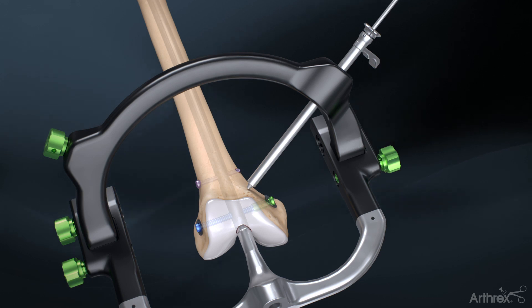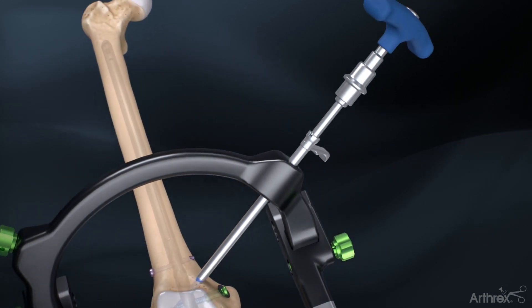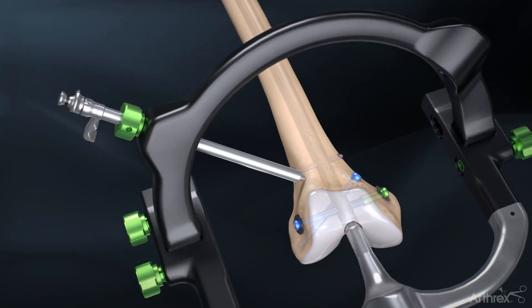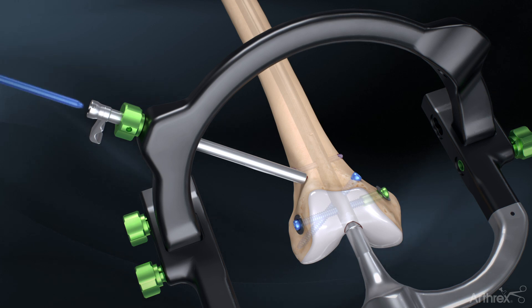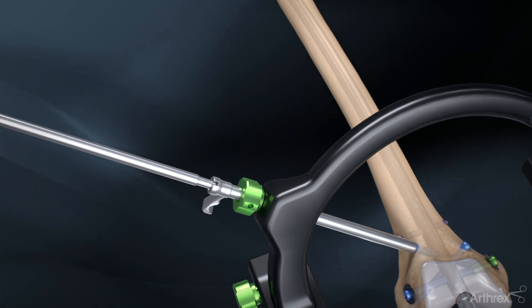Repeat the screw insertion process through the anteromedial hole in the targeting guide. This process is repeated with the screw sheath, drill guide and obturator assembly through the anterior lateral hole on the guide. Remove the obturator, drill bicortically with a 5.5 mm drill and remove the drill guide sleeve. Insert another 6.5 mm screw using the 5.0 mm hex driver, using the laser mark for insertion depth, and remove the screw sleeve once complete.